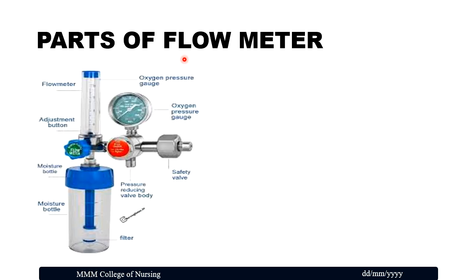So what are the parts of the flow meter? This is a flow meter where we have the readings, and this is an oxygen pressure gauge, where it has a safety valve in it and a pressure reducing valve body, and there is an adjustment button. This is a knob where we can adjust, and there is a moisture bottle. Now the moisture bottle, we are not filling it with water, it's plain dry oxygen we administer to the patient. So these are the parts of the flow meter.